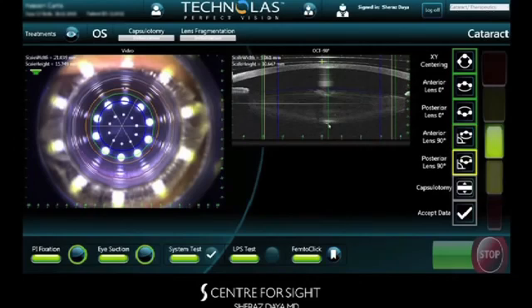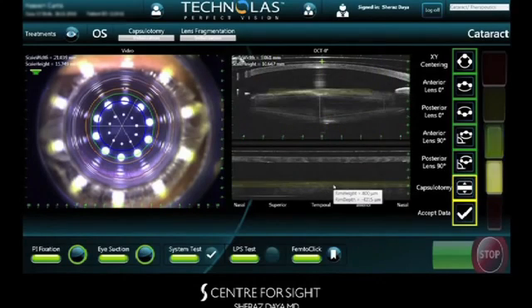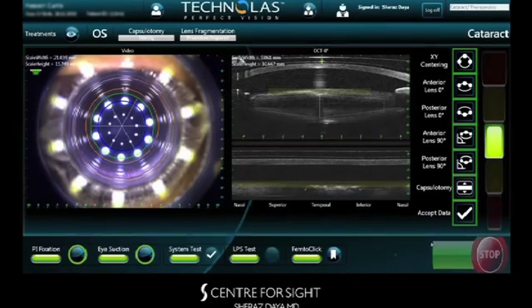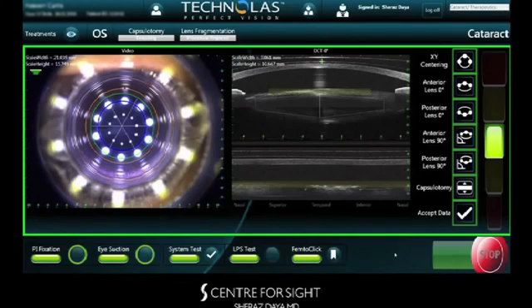Once accomplished, another OCT image, the ring OCT, is used to identify the level of the anterior capsule by unfolding this 360 degrees. The green band identifies the width of the laser cleavage, ensuring the capsule is resected 360 degrees, ensuring there are no tags or bands. Once this is confirmed, laser ablation commences with the capsulotomy. Notice the fine gas bubbles at the level of the anterior capsule, as well as resection of the capsule on OCT.